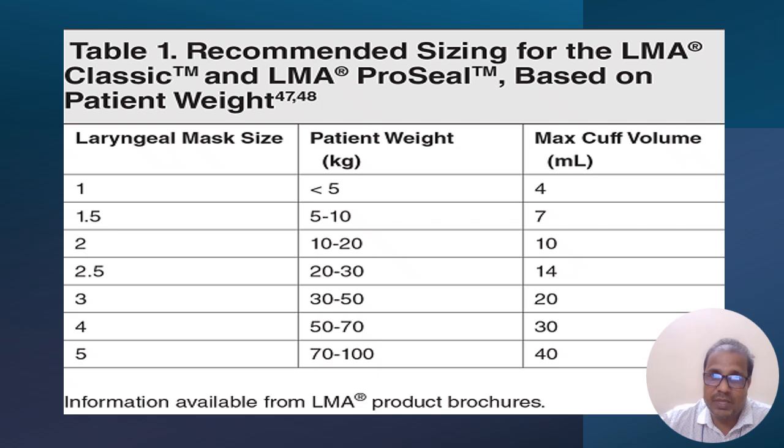Different sizes of LMA have different cuff volumes, and we will inflate the cuff through the inflation channel according to the size and the volume of the cuff.